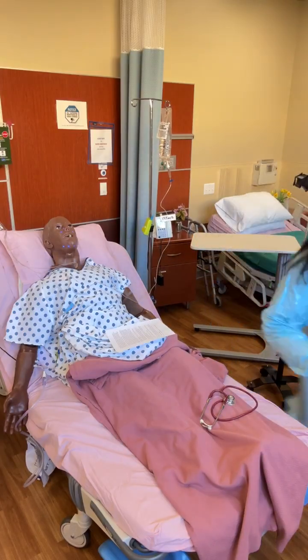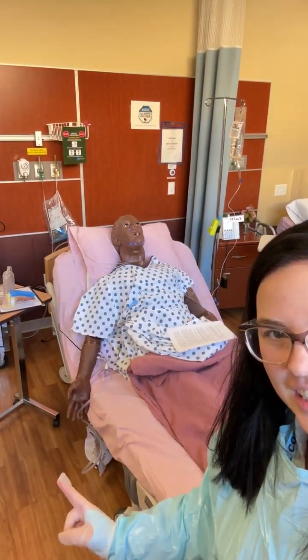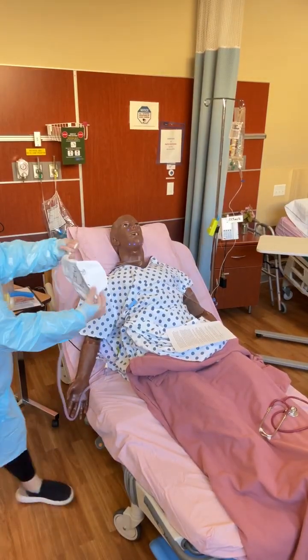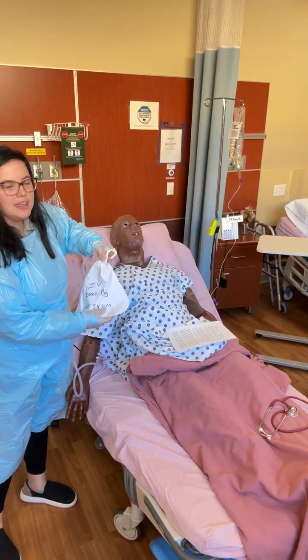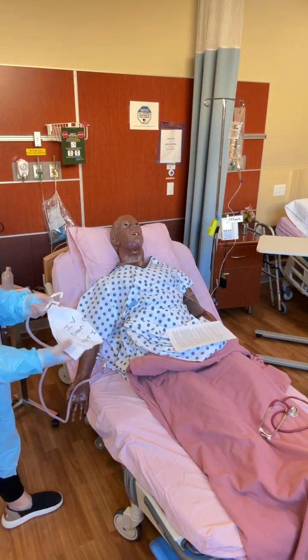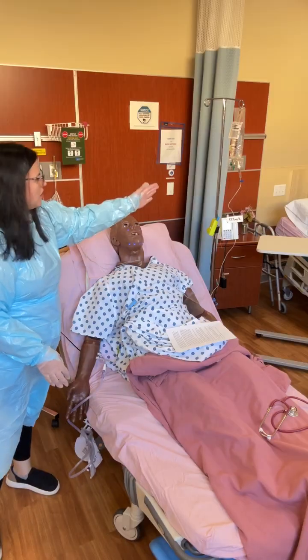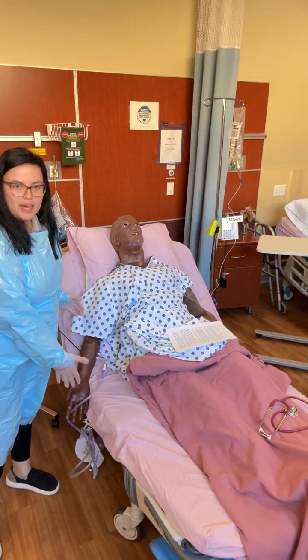Sorry, I have to go back over to the other side. So right here, you can see it right there. It looks like the patient has a Foley, but if you look at it, it says it's an IV drain bag, not in play. So that's all it is, collecting the fluid that you put into the simulator. So you don't need to assess the liquid or anything that's in here. All that tells you is that you can hook things up, push stuff through his IV, and the fluid's going to go into that bag.